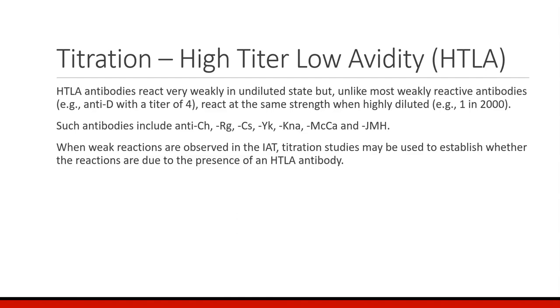When weak reactions are observed in the indirect antiglobulin test, titration studies may be used to establish whether the reactions are due to the presence of an HTLA antibody. And most transfusion services, the busy ones, will do this when a HTLA is suspected.